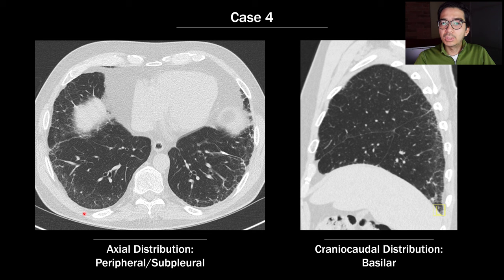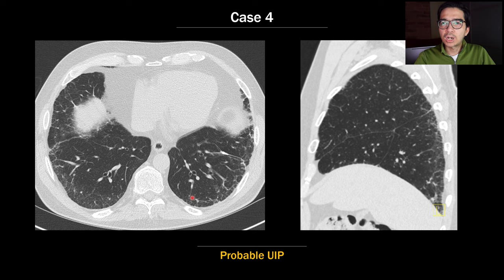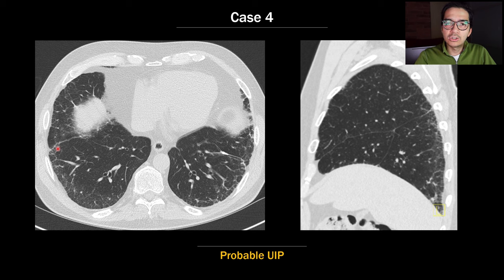This fourth case has a bit more disease: peripheral and subpleural fibrosis with reticulation, basilar predominant on the sagittal. There is a little ground glass opacity, but it is confined to the areas with reticulation. I would likely call this probable UIP, though a colleague might call it indeterminate — and if I'm on the fence, I might look at additional clinical history like the patient's age and smoking history to tip the scales.